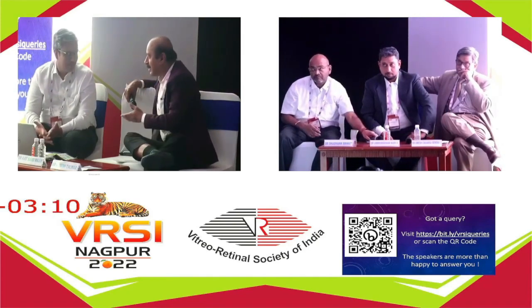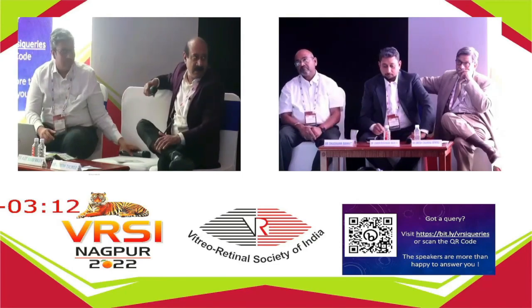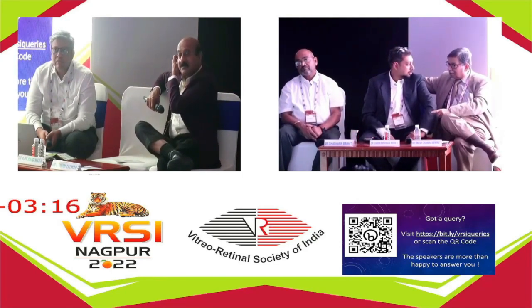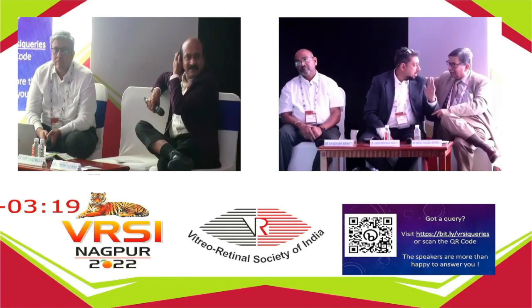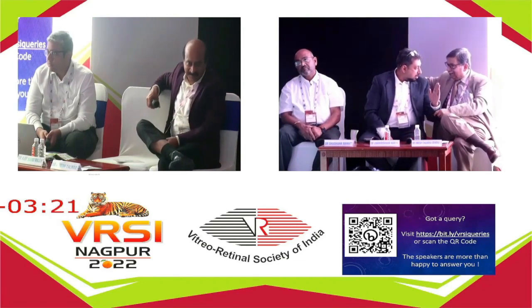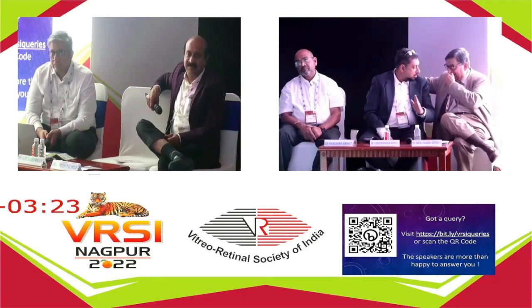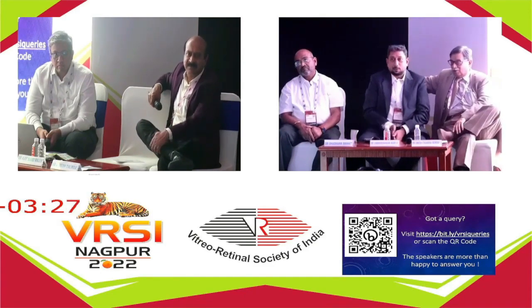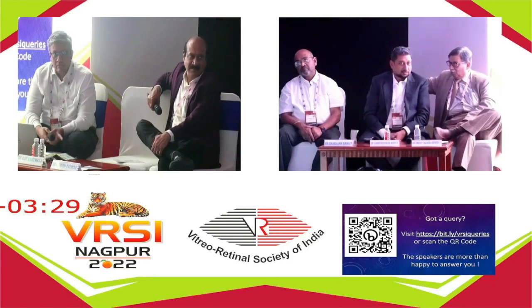Congratulations to the panel. It's a very nice presentation. Also, a lot of nice comments. I think one of the things that we have to bear in mind is that FA only assesses the superficial capillary plexus. In OCTA, you can actually see the superficial, intermediate, and deep. That's important information because it's completely different information.